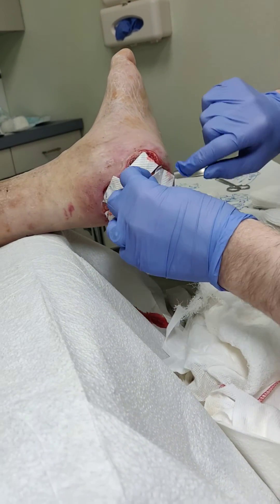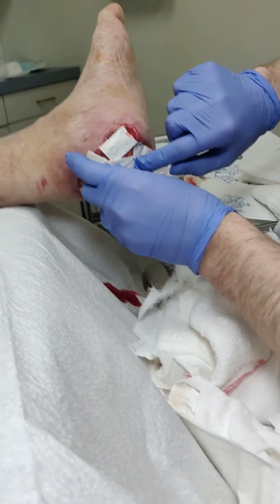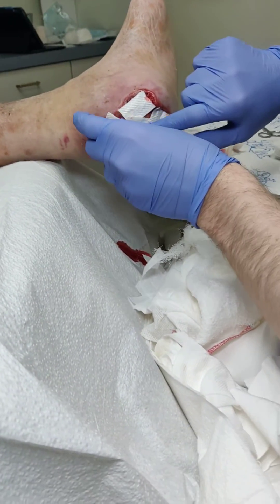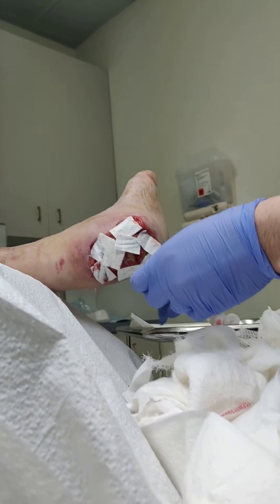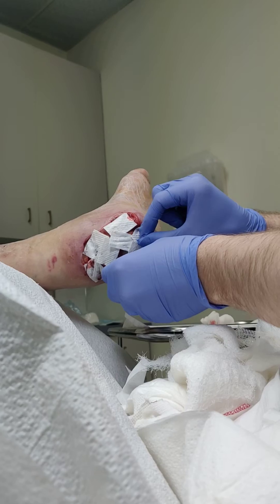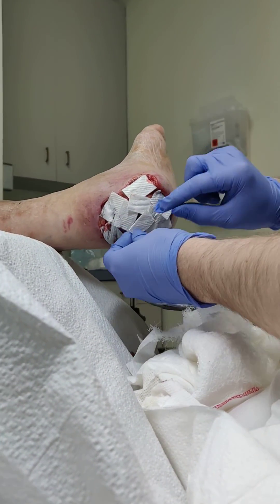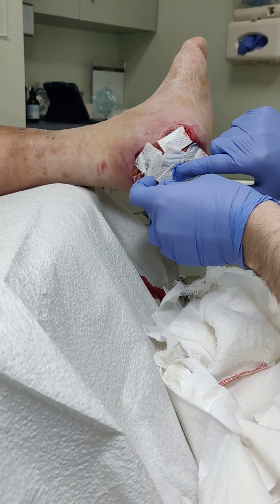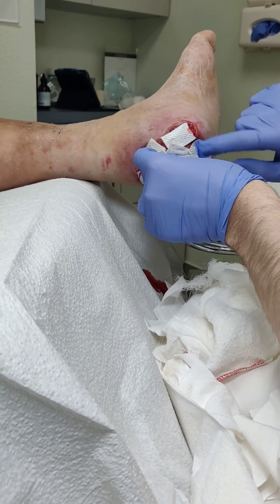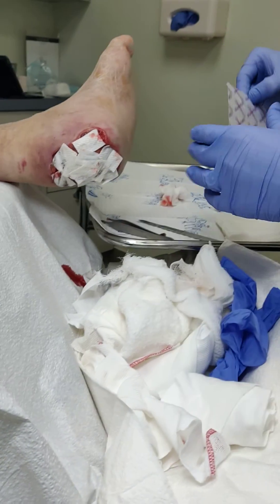Speed is of the essence because when we have patients with an open wound like this, any infection he might get could be devastating. The longer this wound is open, the higher the risk we have for a severe infection that jeopardizes the entire limb. Now we've covered everything, and we're going to secure this in place with a mesh called Mepitel to help keep this on. We will see him back next week to see how well this has incorporated.